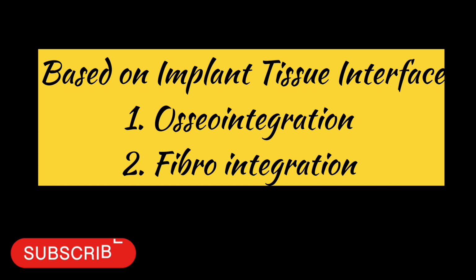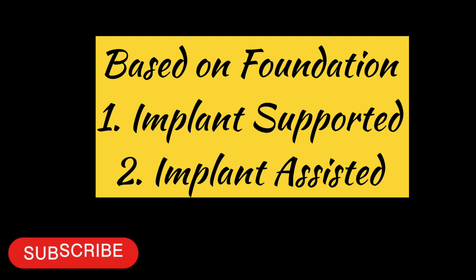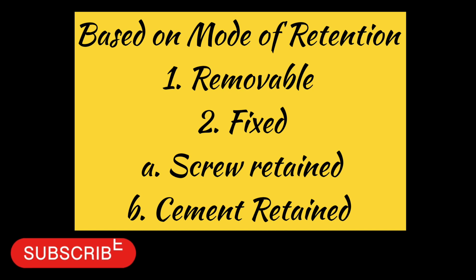Based on implant tissue interface, we have osseointegration or fibrointegration. Based on foundation, we have implant supported or implant assisted. Based on mode of retention of prosthesis, we have removable or fixed. In fixed, we have screw retained or cement retained.